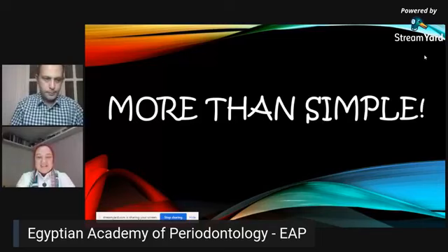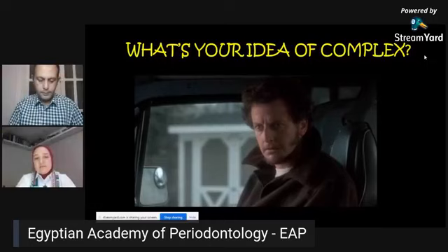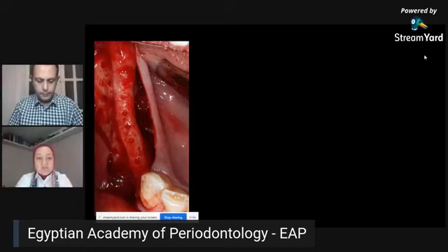Today we are going to discuss some cases that are more than simple, more than the simple cases that we face every day. The challenges that we see, things that we think about and maybe ask our colleagues and professors and mentors about their opinion of it. So what's our idea of complex cases or the cases that are more challenging to us as clinicians and implantologists? Cases like thin ridges, like the one we can see here. When you see a thin ridge, it's really your nightmare. You really don't want to have this a lot because it's not usually a straightforward case that you can just put the implant and go home happy. You have to do something about it.